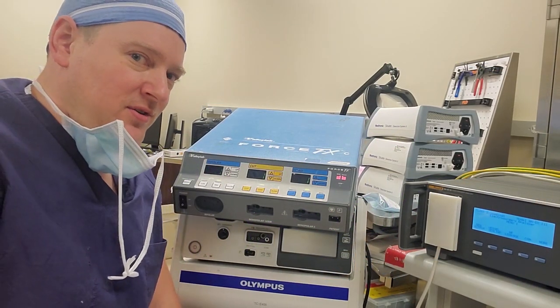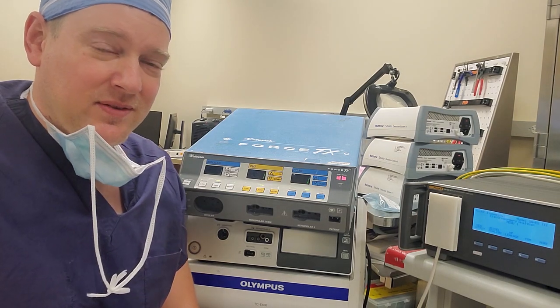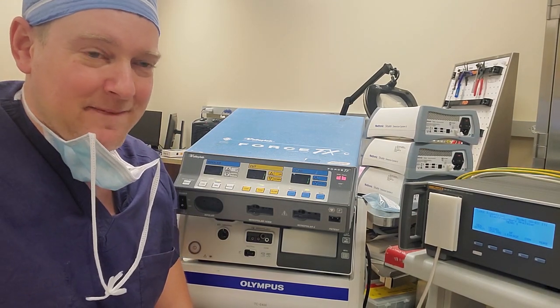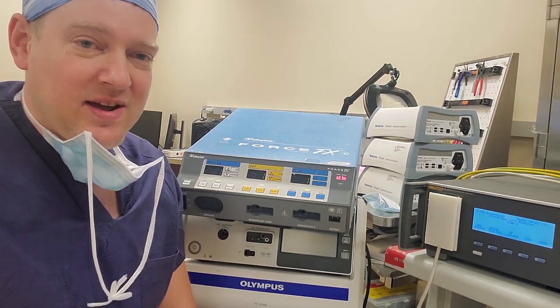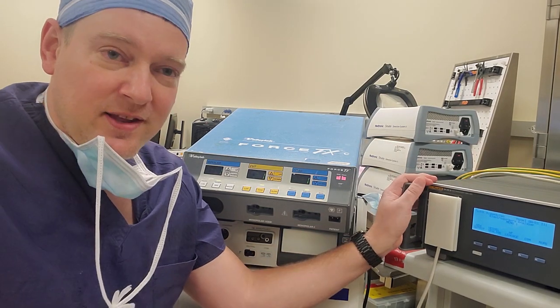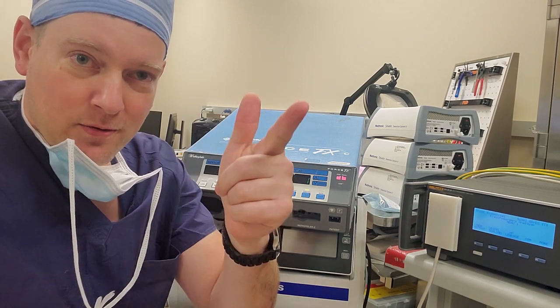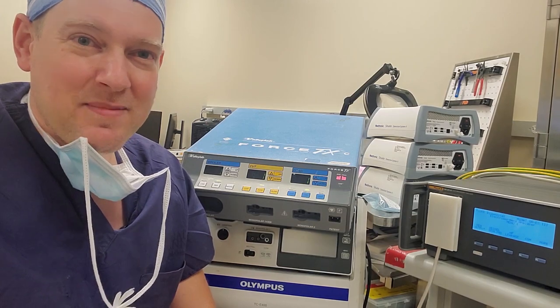Have you guys noticed that when you're doing the PMs on these ESUs, they're starting to creep? They're starting to get a little older and they're probably not within spec. I noticed, and I went through all the process of the calibration. We're going to do it right here on the Fluke QAES3 with you guys step-by-step, coming up next right here on Better Biomed.